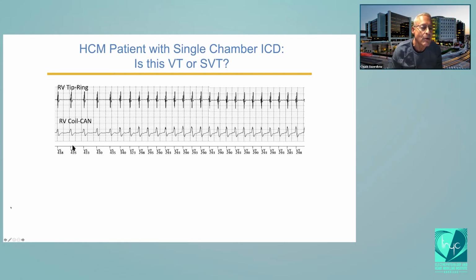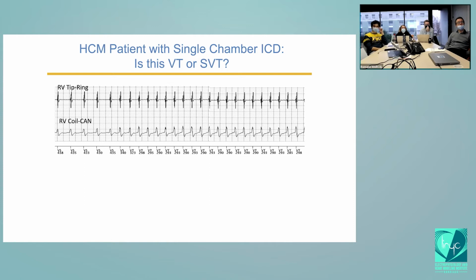I just want to say the onset seems relatively abrupt, and the morphology changed at the same time. It's not much different, so I don't know if this is sufficient to discriminate it, but it definitely looks different from the second to last VS one.